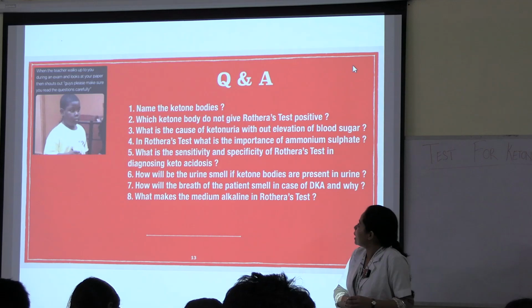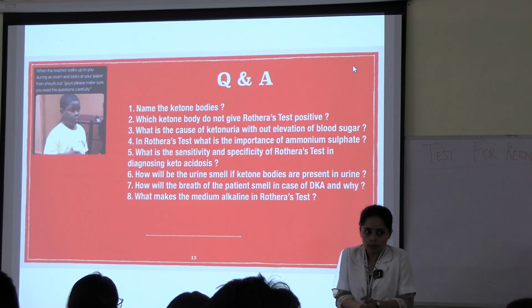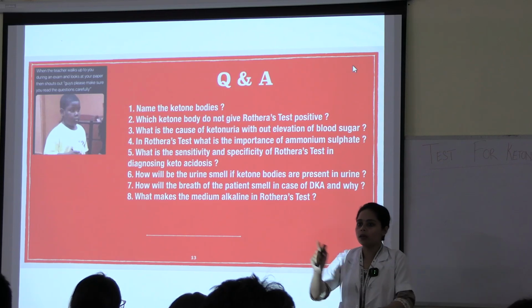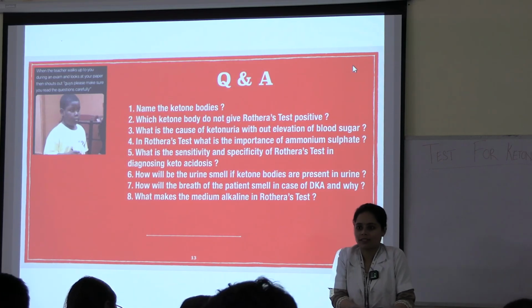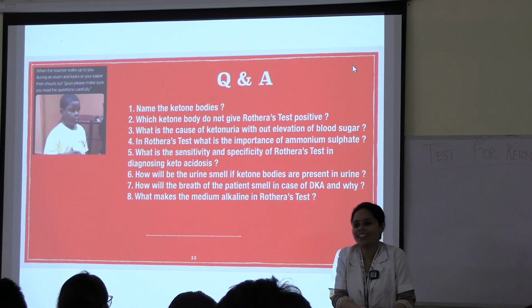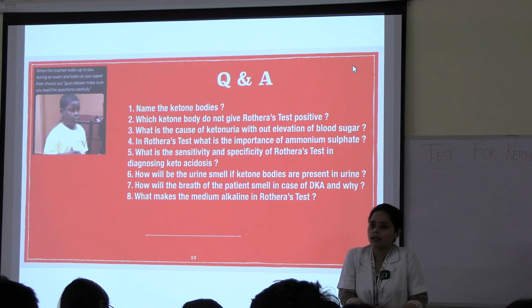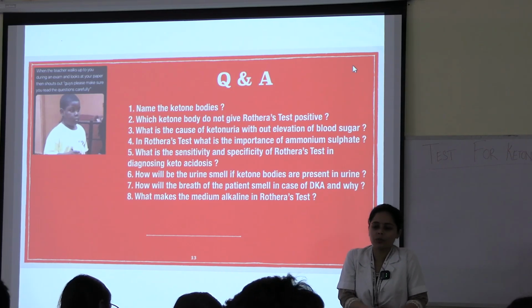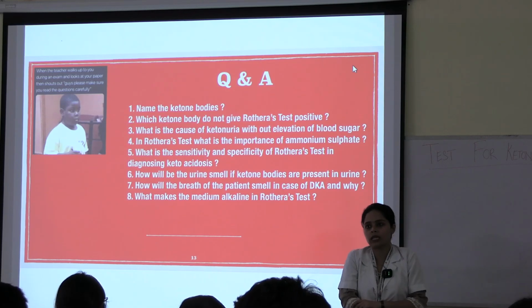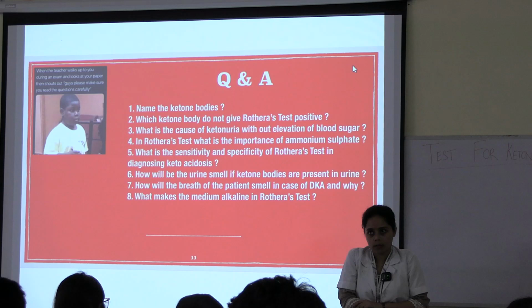What is the sensitivity and specificity of Rothera's test in diagnosing ketoacidosis? I'll ask one by one. Tell me, what is the sensitivity of the test? Try in English. You cannot speak in Hindi in front of the external. You cannot tell the exact amount of ketone bodies. It may be a little amount, but a traceable amount.